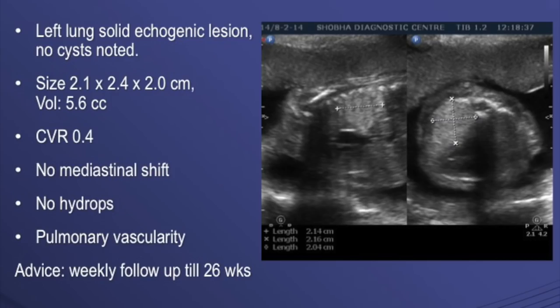Let's look at a CPAM case. How will you describe this lesion? This is involving the left lung. There is a solid echogenic lesion. There are no cysts noted. The size is so and so with the volume so and so. The CVR was 0.4. There is no mediastinal shift, there is no hydrops, and it shows normal pulmonary vascularity.